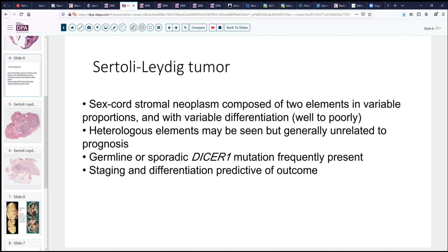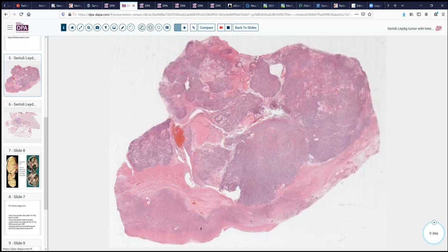There are a couple of particular histologic types that are worth being aware of, and one is the Retiform subtype. So here's another tumor, this one presenting at a more typical age in a 20-year-old with some menstrual abnormalities. As you can see, it has a lobulated, solid appearance, a few follicular cystic areas, and some preserved ovarian parenchyma at the periphery.